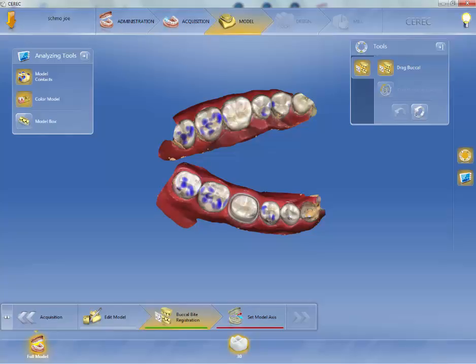After your model is open and you've verified your occlusion, your next step is going to be Set Model Axis. As you can see at the bottom, we have Buckle Byte and Set Model Axis.